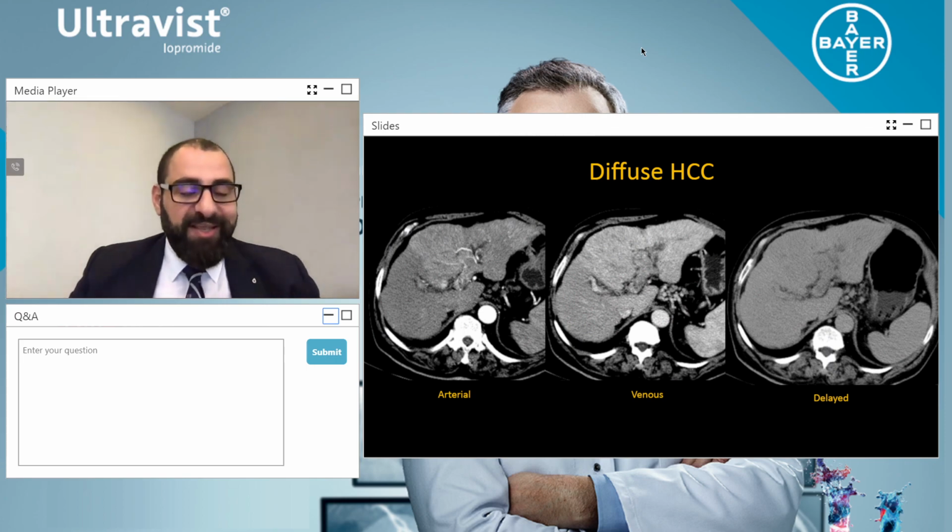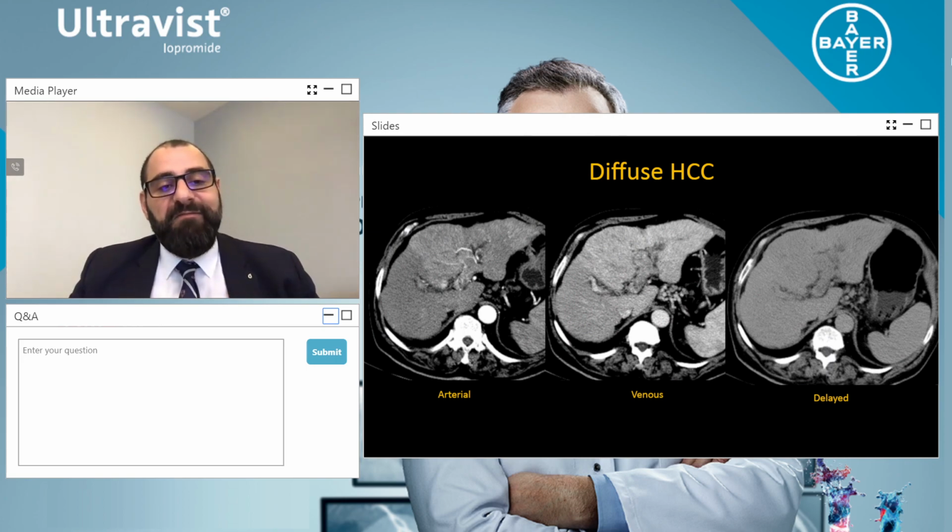But what are the errors here? They never used saline. The density of contrast was not dense enough. They didn't use a low kVp. More importantly, the monomer did not diffuse equally and perfectly, and our waiting time wasn't right. It should have been at 8 seconds. What I'm trying to show you here is that delivering your contrast media with the combination of these techniques really shows and portrays the enhancement patterns of these lesions.